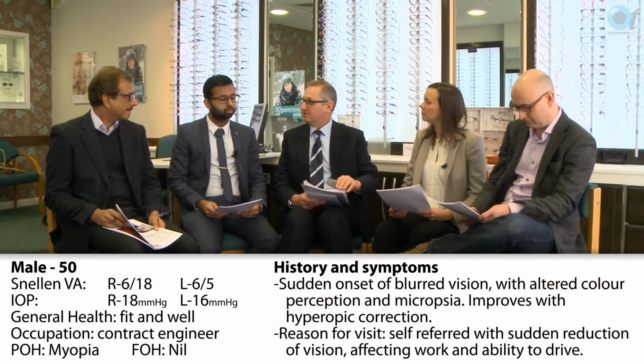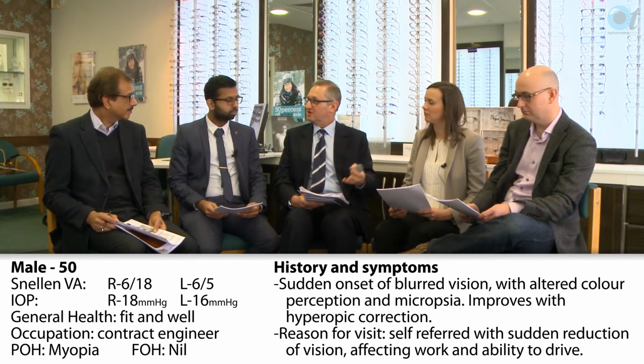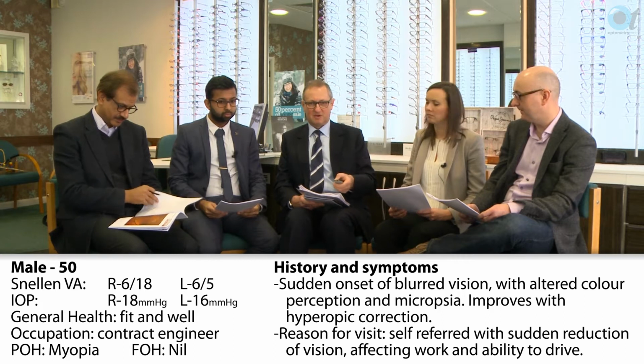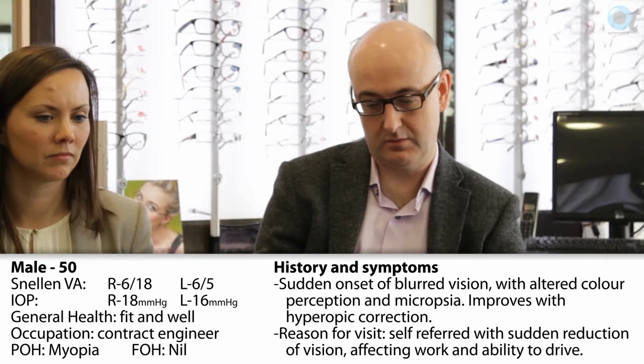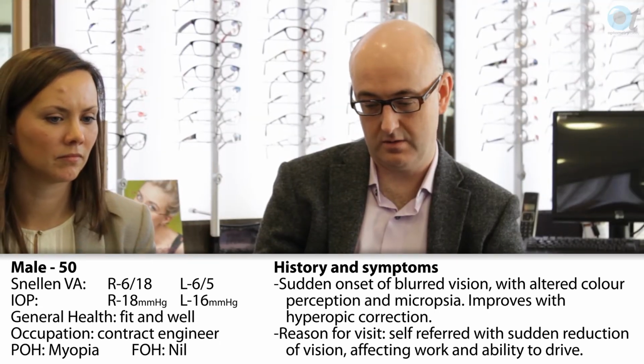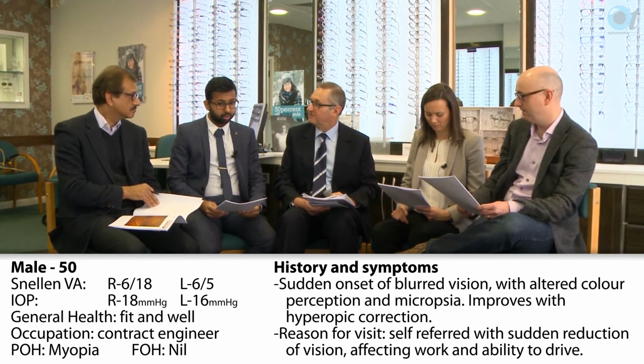If we could start off by having a look at the OCT images and then get some discussion going about what you think you see. So if somebody would like to have a look at the OCT image and tell the group what they think they're looking at. Well, there appears to be an elevation of the sensory retina from the pigment epithelium. So this could indicate a central serous retinopathy. Has anybody else got any further comments?